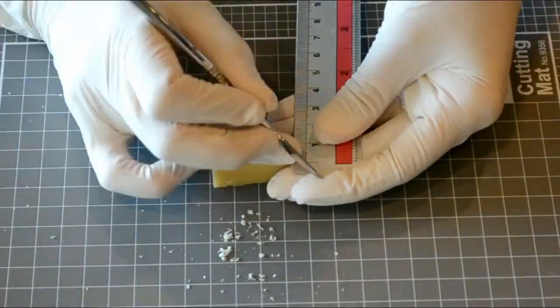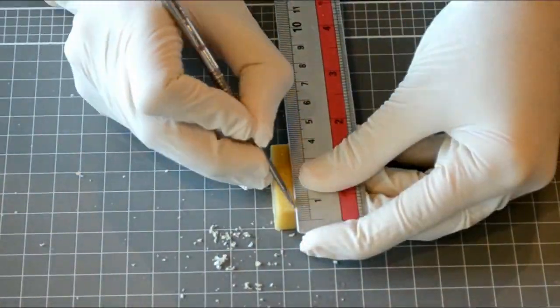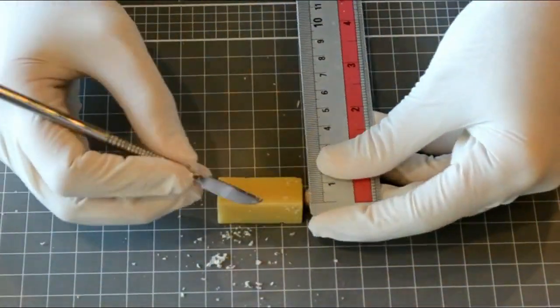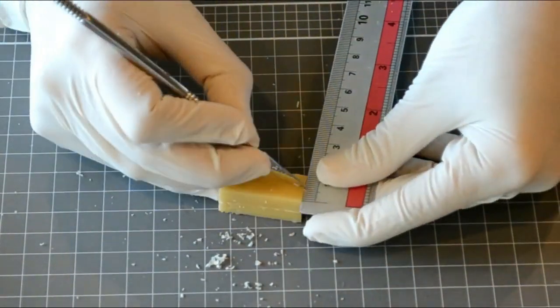Next, carve a vertical line at the center of each aspect using your lecron carver. This will help you accurately plot your measurements on the wax block.